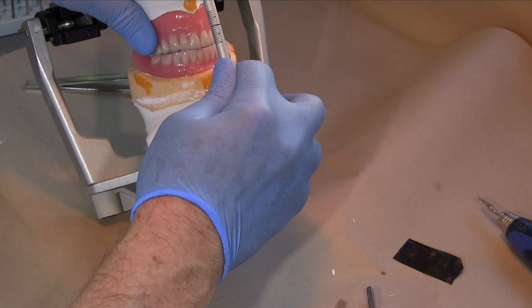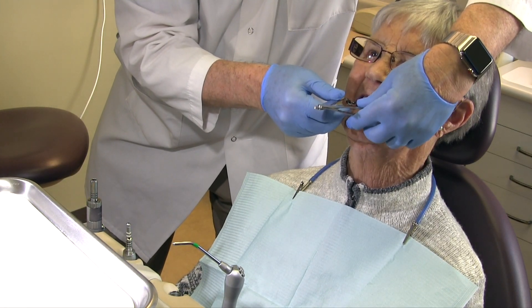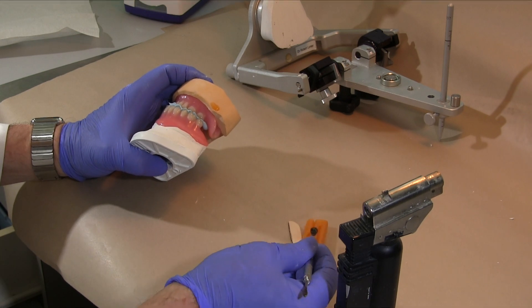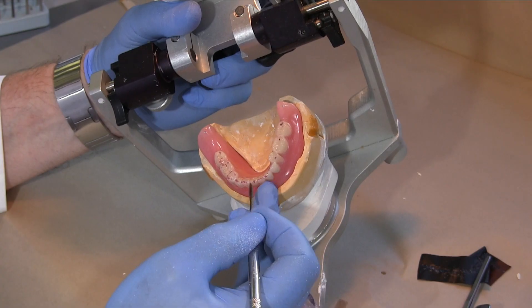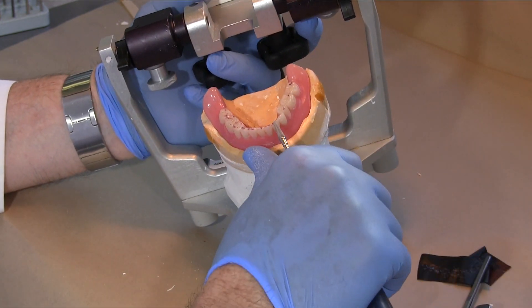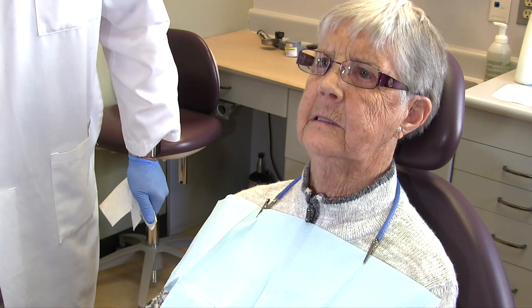Clinical remount of complete dentures. While some clinicians avoid clinical remounts because they believe making intraoral adjustments is faster, this video will demonstrate an expeditious remount technique that should actually reduce the amount of overall clinical chair time needed to eliminate denture complaints related to occlusal errors.